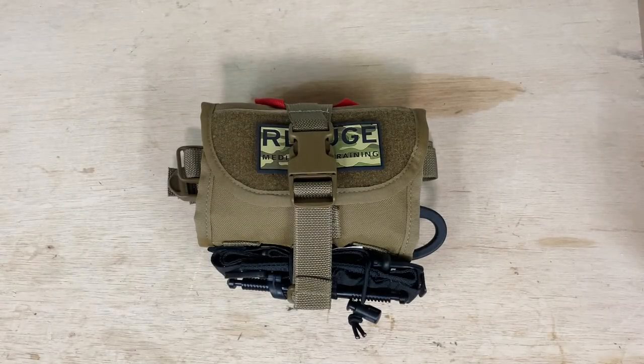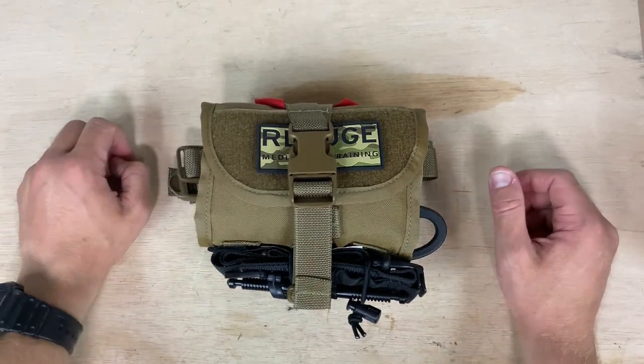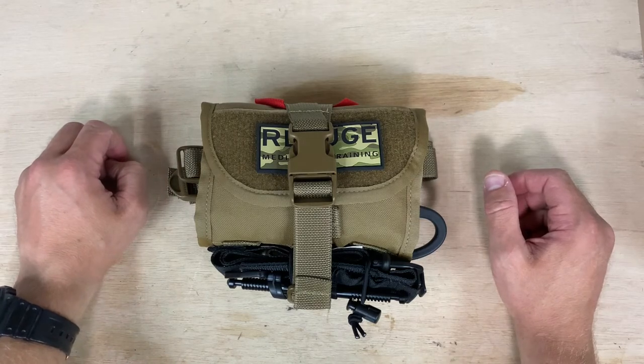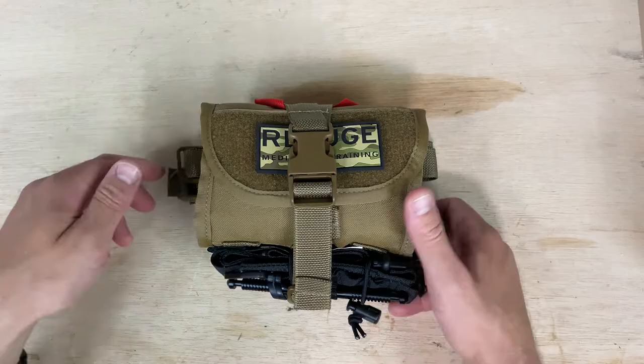Howdy everybody, Essential Gear here. So what you're looking at is the ARC kit from Refuge Medical. It's one of their newer kits. I've had it for a few days now, so I've kind of formed my initial impression of the thing. Just wanted to get a quick video out on my thoughts.